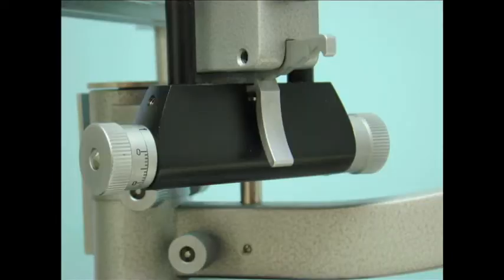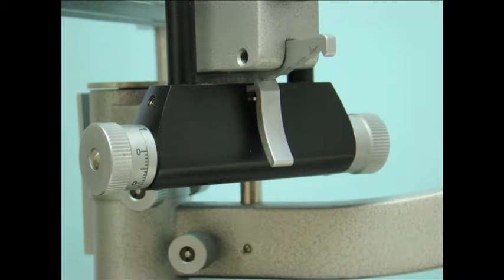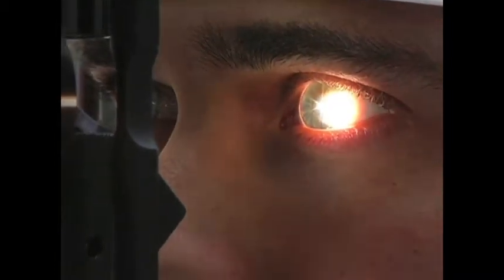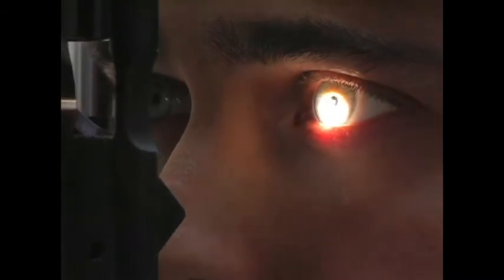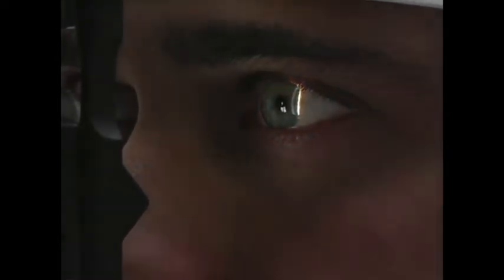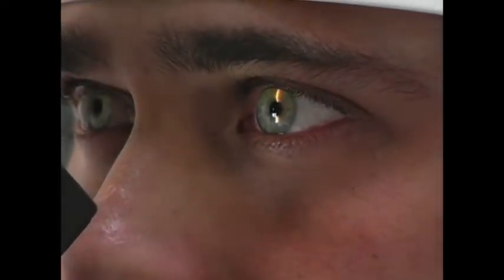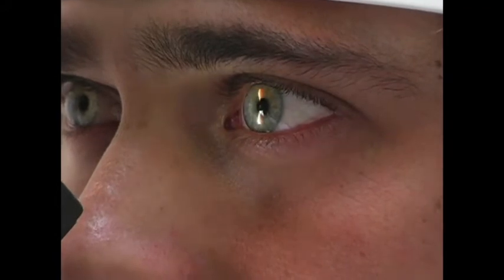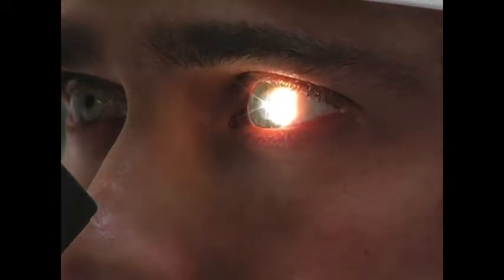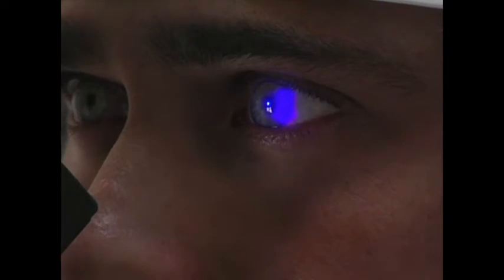The lower control knob adjusts the width of the beam. In general, a tall wide beam is used for scanning the eyelids, conjunctiva, and surface of the cornea, while a narrow beam is used for examining the anterior segment structures of the eye. The upper control knob can also be used to add a cobalt blue light filter, which is used to examine a fluorescein stained eye.